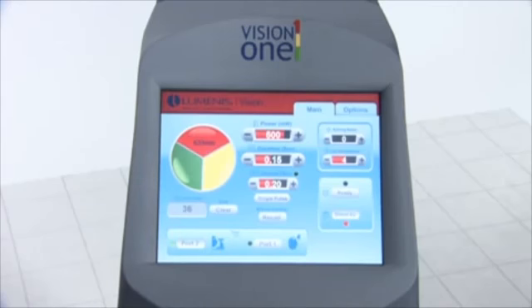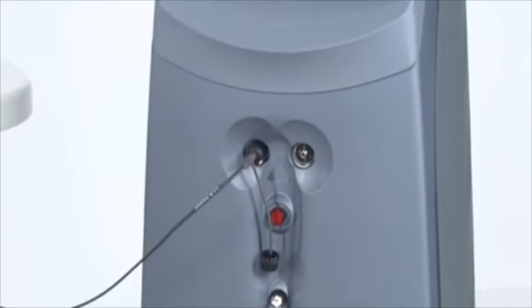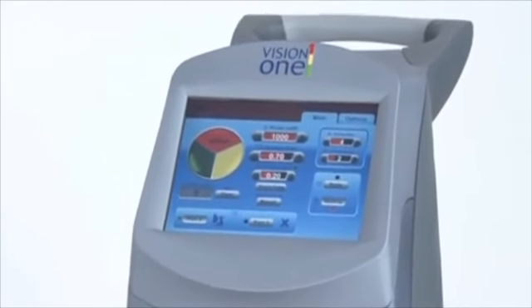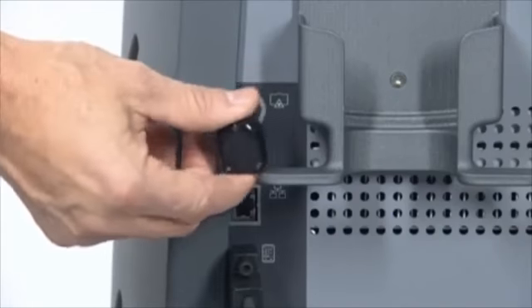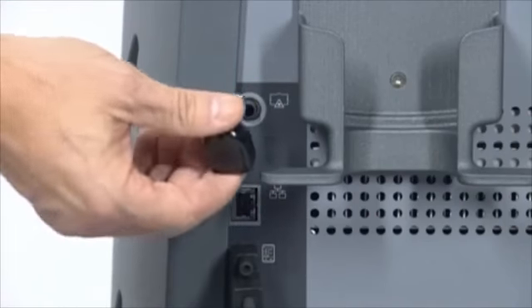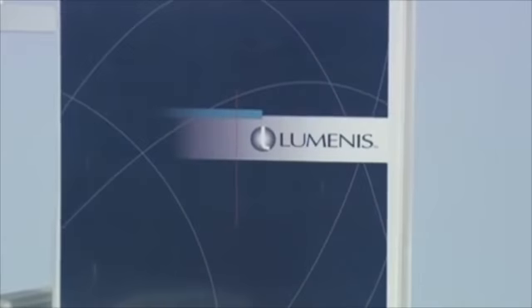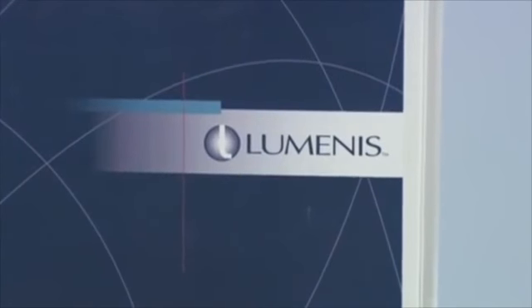Operation and adjustment controls are located so that the user need not be exposed to laser radiation during the laser operation or adjustment. The laser has a protective housing that prevents unintended human access to laser radiation above Class 1 limits. The housing must only be opened by a Lumenis certified technician. An external door interlock receptacle and plug are provided to disable the laser if the treatment room doors are opened. Refer to the laser safety eyewear section of your operator's manual for additional information.